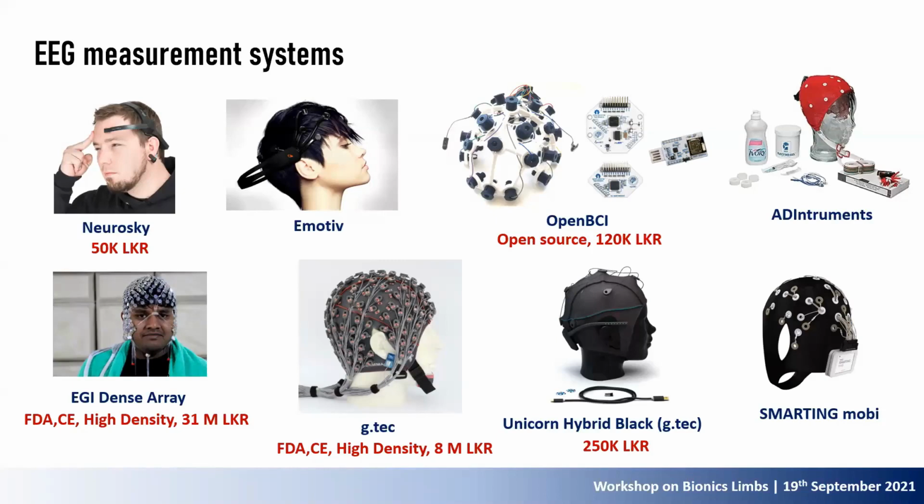So you can understand the price factor of these EEG systems, because these are highly advanced systems that can measure very tiny details of brain signals.